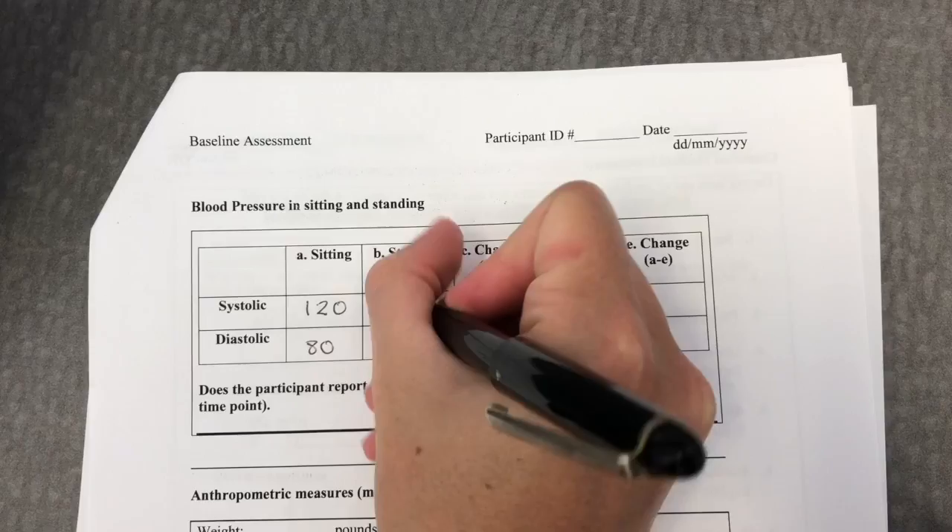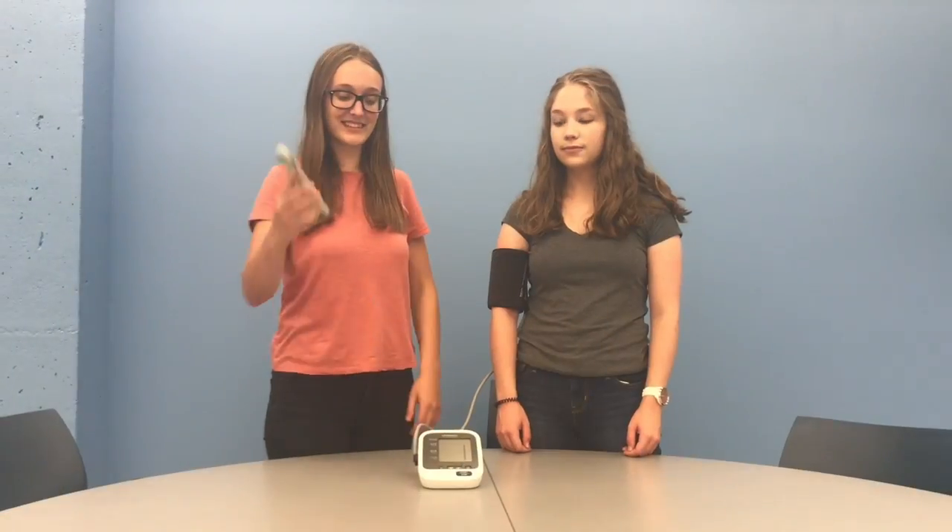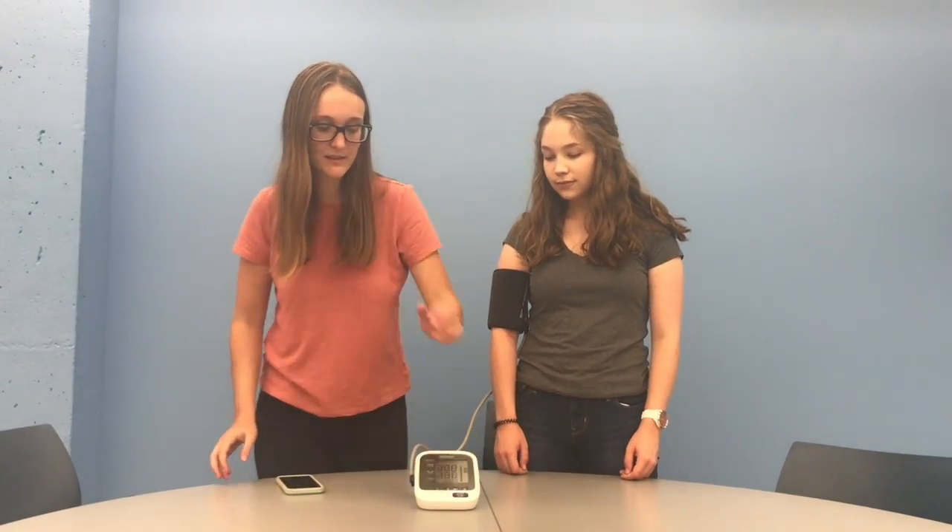After the first standing blood pressure values have been recorded, again keep the blood pressure cuff on the arm and set another timer for 2 minutes. Once these 2 minutes are up, record the blood pressure for the final time.